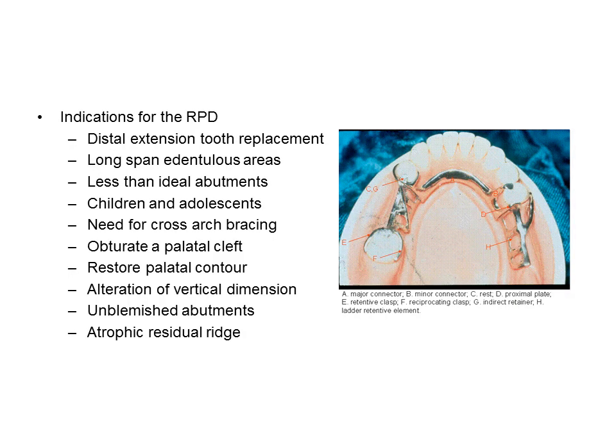Numerous indications exist for the clasp retained removable partial denture. In patients who will not be treated with endosseous implant therapy or conventional fixed prostheses, the removable partial denture may be employed. The most common reason for the use of the removable partial denture is the distal extension base, that is, an extensive edentulous space unbounded by a terminal abutment. Other indications include long tooth-borne edentulous areas, and patient financial considerations.